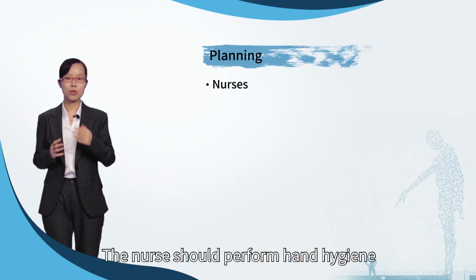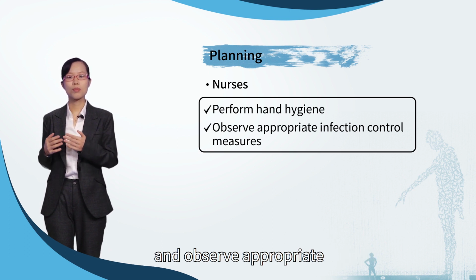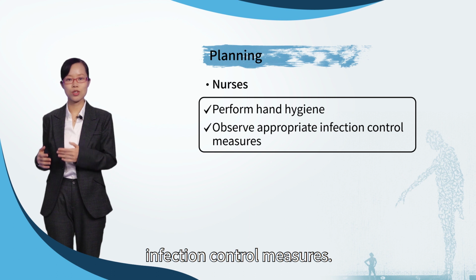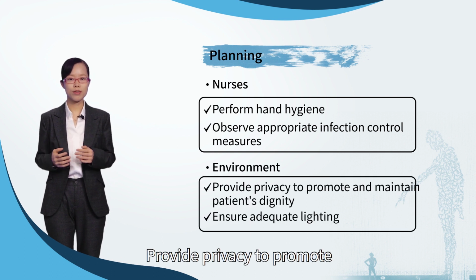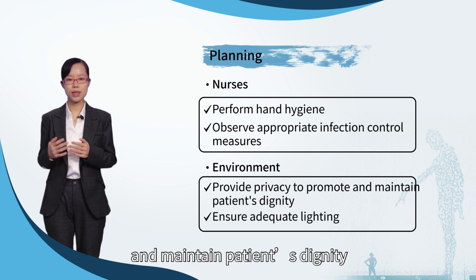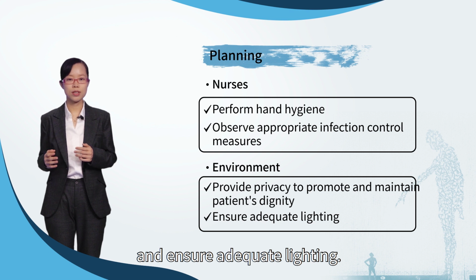The nurse should perform hand hygiene and observe appropriate infection control measures. Provide privacy to promote and maintain patient's dignity and ensure adequate lighting.